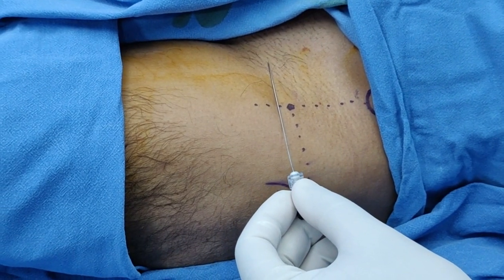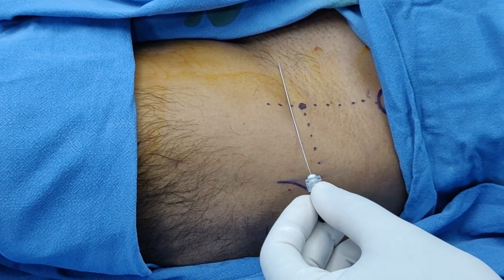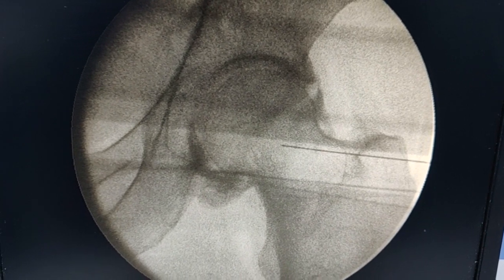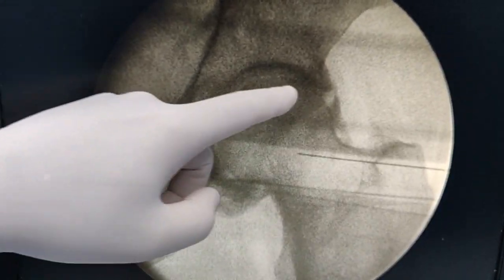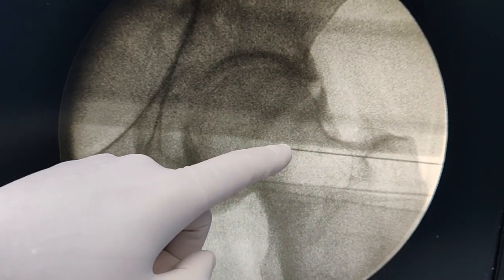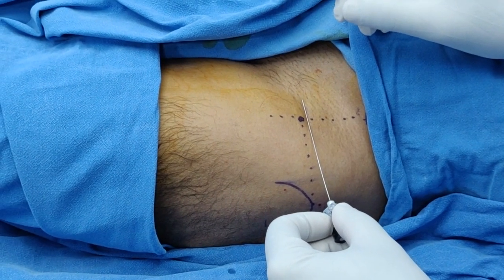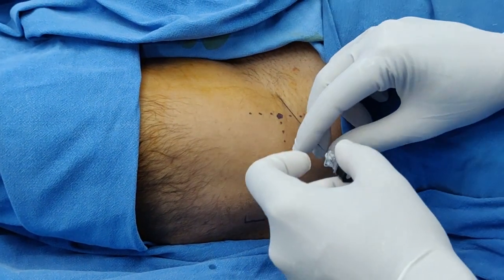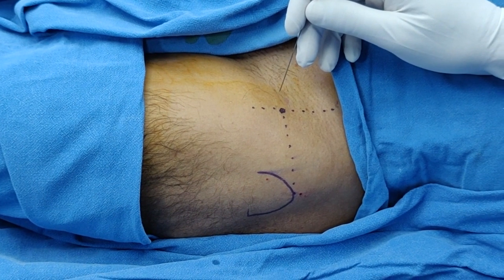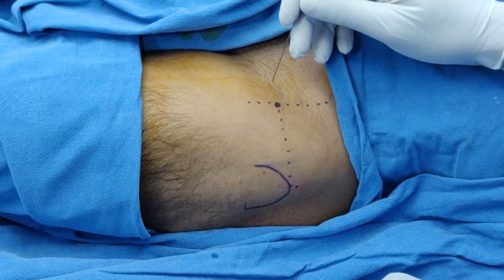If you prefer an anterior approach, I want to show you where you should be. Take an AP view with the needle under fluoroscopy. After putting the needle in from the front, your needle apex should be in the center of this area — this is where the capsule is. Once you are happy with this position, all you need to do is make your needle go perpendicular and go straight onto the neck, pierce the capsule, and you should be able to inject. However, I would always recommend using Omnipaque to confirm your position before injecting the drug.